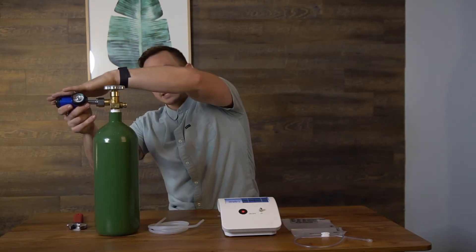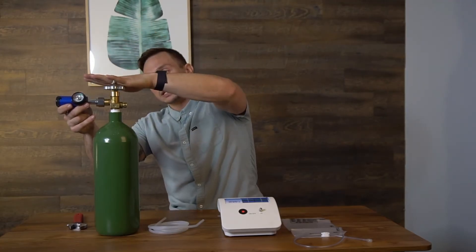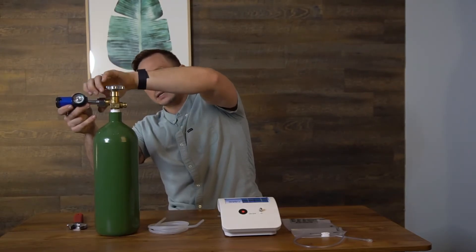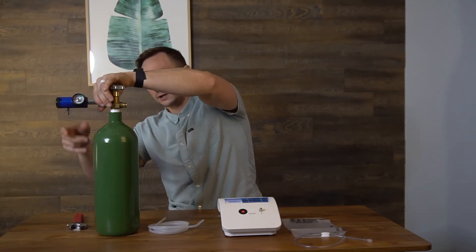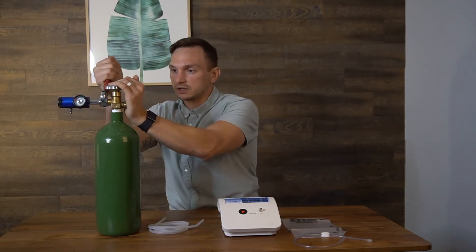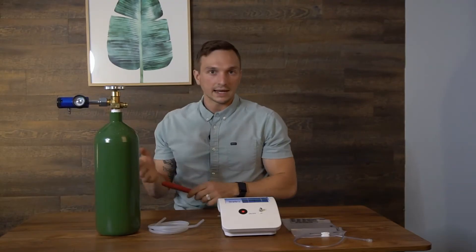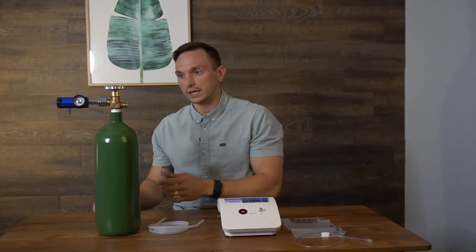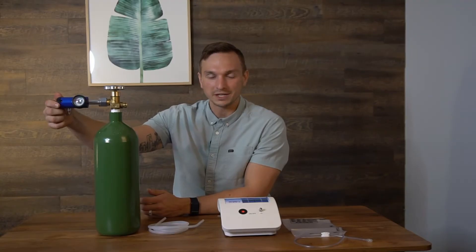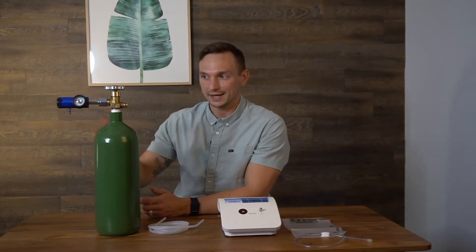The first thing I'm going to do is connect my regulator to the oxygen tank. I'm going to put the stem into the side here and then finger tighten it using this nut. It might need a little additional tightening. You'll know if it's not tight enough because you'll hear a hissing sound — that's oxygen escaping the regulator. Also make sure the regulator is set to zero before you put it on, because if it's not, you'll hear that hissing sound and might think it's leaking, but it's not.